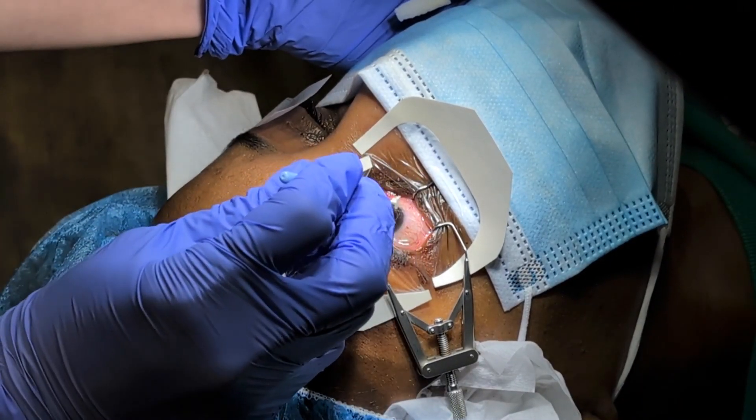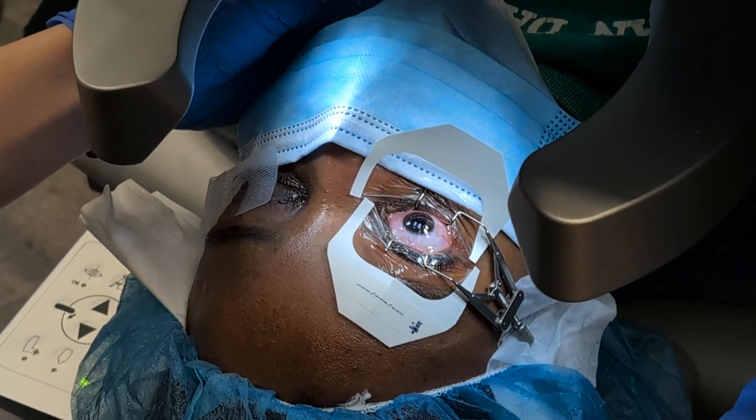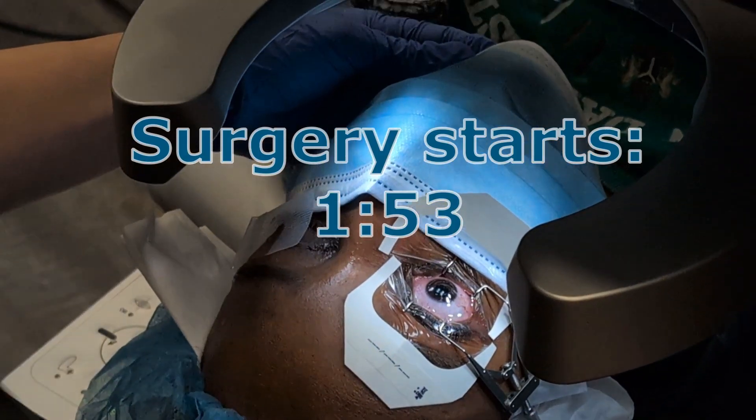Most videos show you just what the surgeon sees, but we took pains to show you both the surgeon and the patient at the same time. If you're short on time, the actual surgery starts here. Have you ever considered PRK or photorefractive keratectomy but were nervous about what the procedure would be like? Scraping off the surface layer of skin of your eyeball and then applying a laser to physically reshape the cornea underneath does indeed sound a little jarring, even to me, and I'm the one performing this procedure. In this video we'll watch a PRK procedure from start to finish, and this will give you a good idea of what to expect if you or someone you know is planning to get this procedure done.